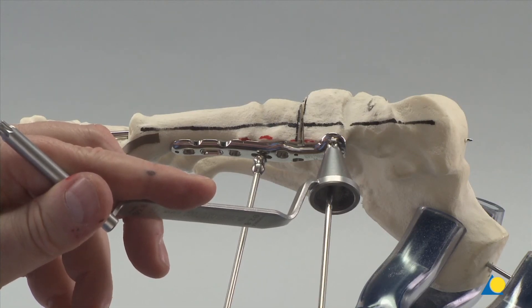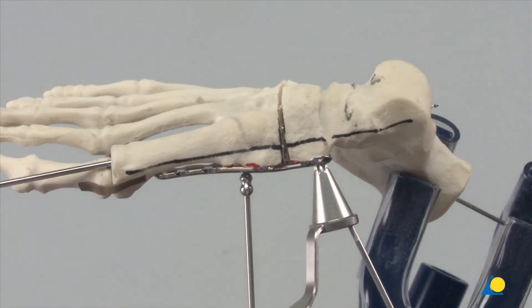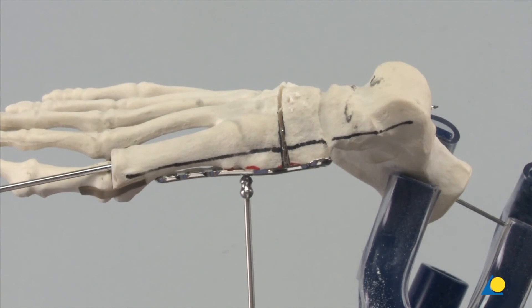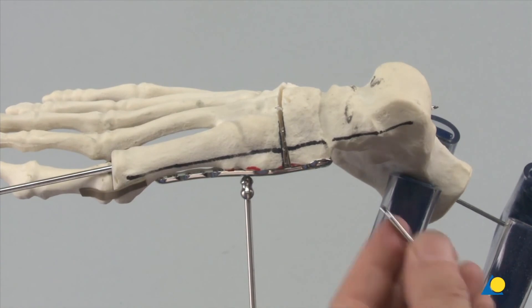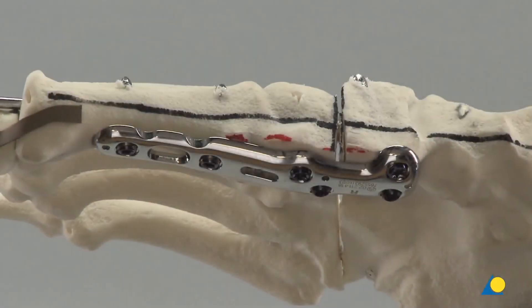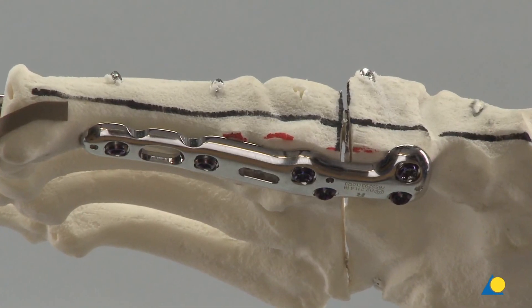The drill is aimed away from the talonavicular joint into the navicular, and a 2.8 mm hole is drilled to the desired depth through the variable end of the VA double drill guide 3.5. Clinically, this can be done under image intensifier control. The depth gauge is used to measure for the correct screw length. The star drive screwdriver shaft and handle with quick coupling are used to insert the correct length screw, and the torque limiter is used for final tightening. The remaining plate holes are filled with 3.5 mm VA locking screws, and the completed construct is shown here.